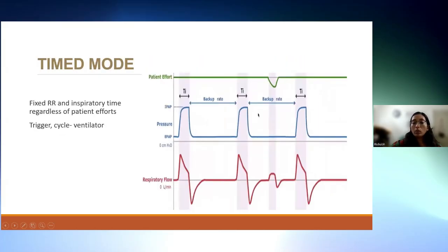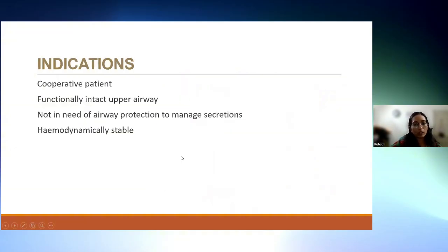In a time mode, there is nothing like patient triggered. Everything is done by the ventilator. So the respiratory rate and the inspiratory time are regardless of patient effort. So the trigger and cycling are by the ventilator.